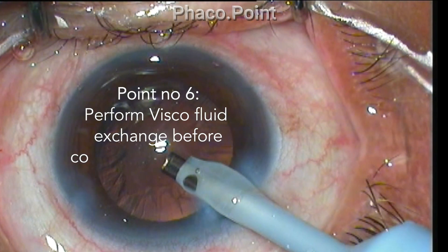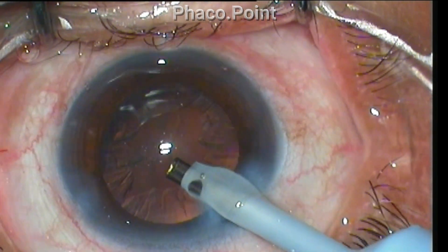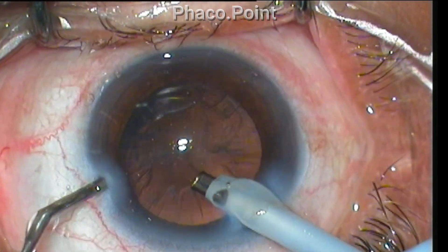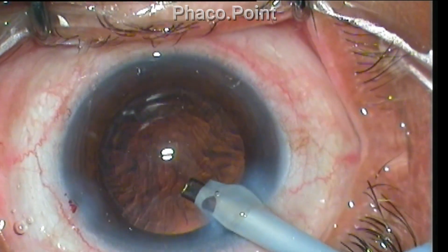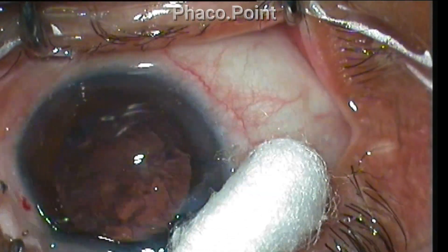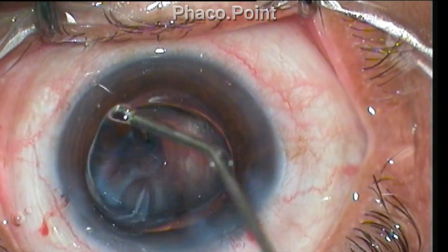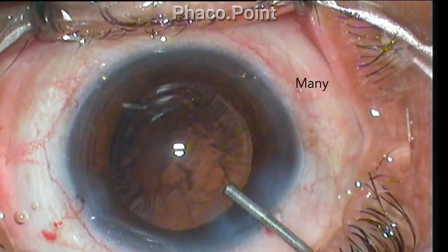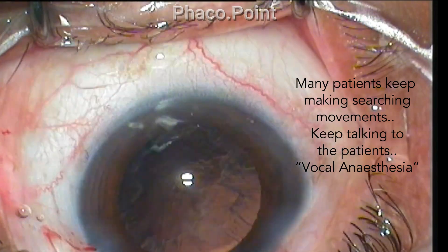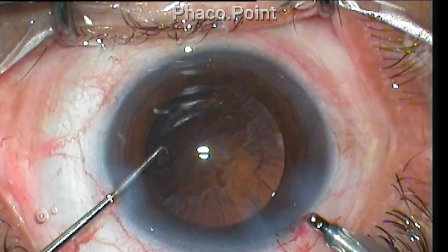Point number six: perform a viscoelastic-BSS fluid exchange before coming out of the eye to prevent sudden shallowing of the anterior chamber, which will cause the patient discomfort. Injecting viscoelastic with the left hand can be tricky, so practice this first on patients who are blocked before attempting it under topical anesthesia. The patient is going to move around a bit — be ready and anticipate it. Always keep talking to the patient during the procedure; my professor called this 'vocal anesthesia,' as it helps the patient to calm down and maintain fixation.